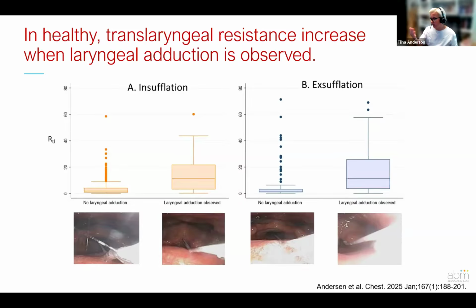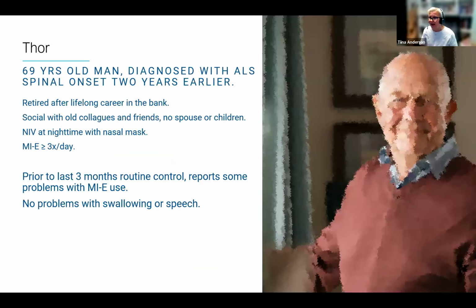So we think that even though we only examined healthy people, the resistance will also increase in patients who have ALS and have this laryngeal closure much more often.